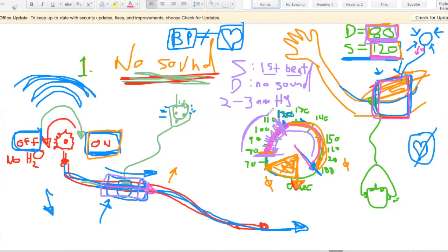Now, there's a couple of different ways to estimate your systolic blood pressure, because when I tighten up the cuff, I don't want to necessarily tighten the cuff all the way to 225 for everybody. Because if you have an elderly individual and you're pumping all of the air into it, I don't know, if somebody's on prednisone, it could be difficult for their skin to handle. In any event, you don't want to unnecessarily pump the cuff up for anybody.